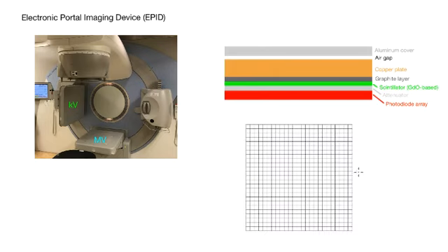So in the end, you have this map. You have pixels, we call them. The image is broken up into pixels. So you might have n by m pixels. And there are many, many pixels, usually millions. For example, you might have an image that's 1024 by 1024.